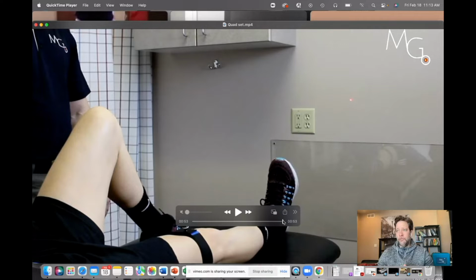And this is a huge value for the motion guidance feedback early on, is that the patient understands that they're losing quad efficiency. If they're going to lose quadriceps efficiency, then they're going to go home and do repetitions of this particular exercise with that inefficiency, which means they're going to lock in the deficit that they would have maybe achieved in your clinic, or that they have before they come back in. And then they would have done tens or maybe hundreds or possibly even thousands of repetitions of a quad set or a leg raise between visits, and they're not maximizing that terminal knee extension.